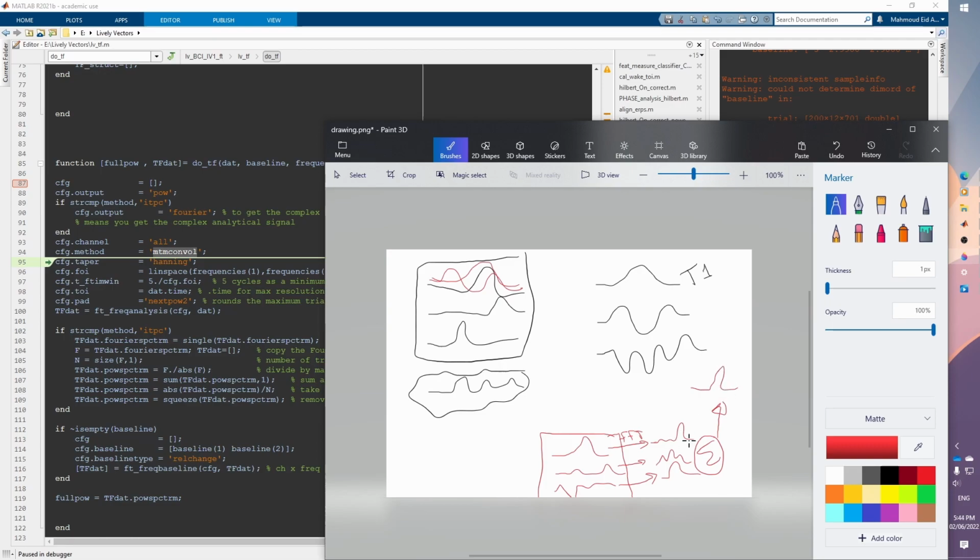And the good thing about this is that it will act as magnifying the thing that was really consistent in frequency, such that if it is not perfectly time locked to the stimulus, it would still appear in the frequency domain, which is good, and it might just smooth other frequencies that were not very prominent in our signals. So that's very brief, I know, but it's just the main idea of that.